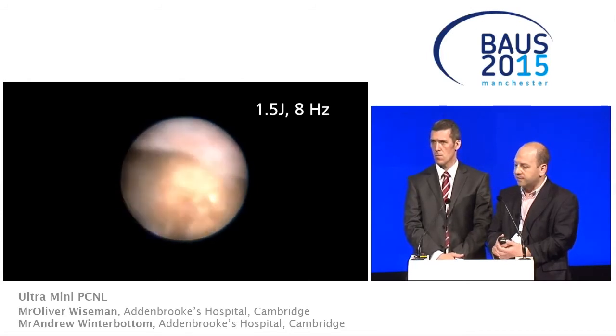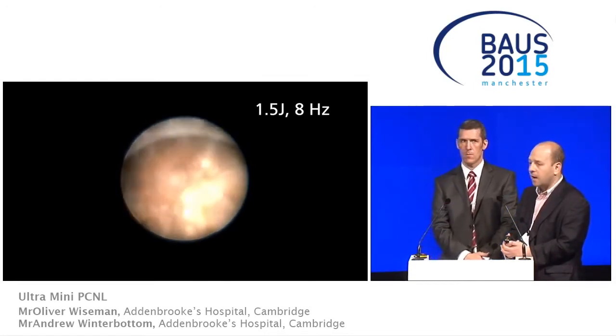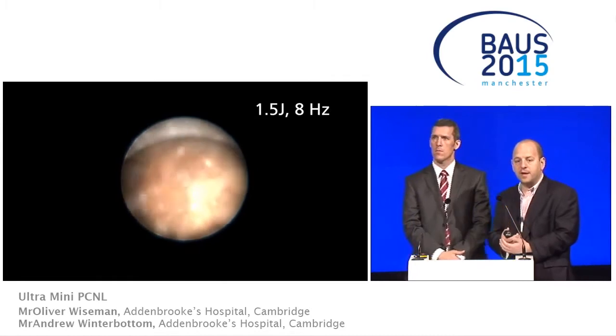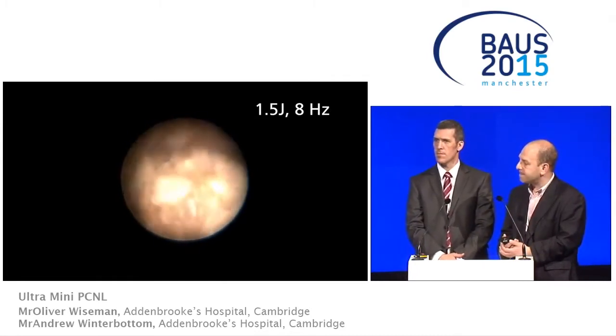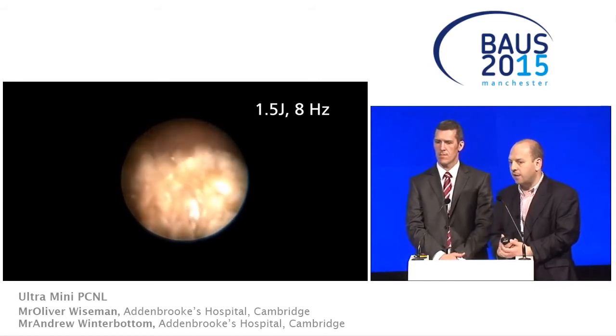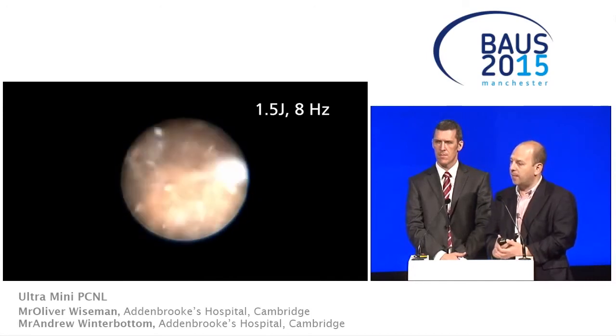So we're fragmenting the stone into smaller bits, and we'll start to wash them out shortly. Are there any other questions that anyone's got about the technique or the kit at all? So there's a question about how long the whole procedure lasted. Well, I like to look at it a bit like the robotic surgeons do with their robotic prostatectomies, where we just talk about the docking time.